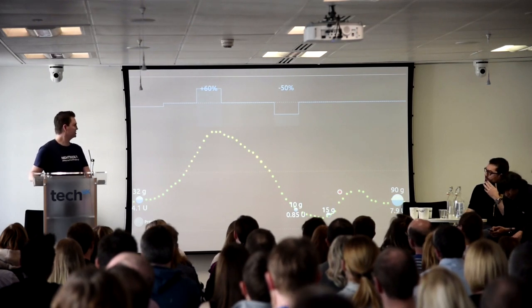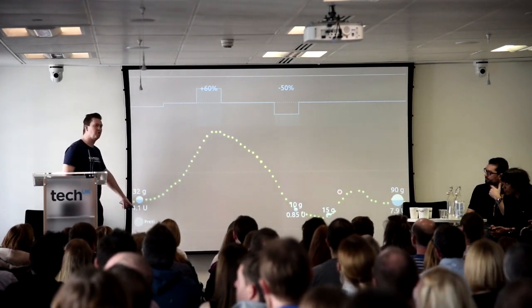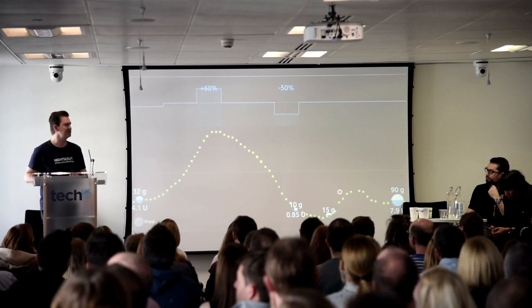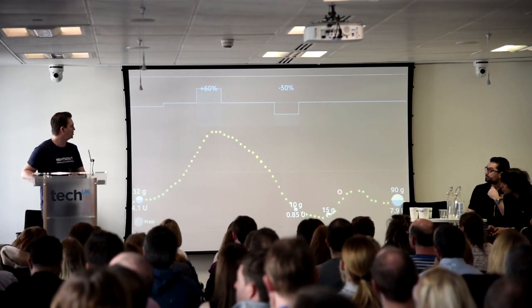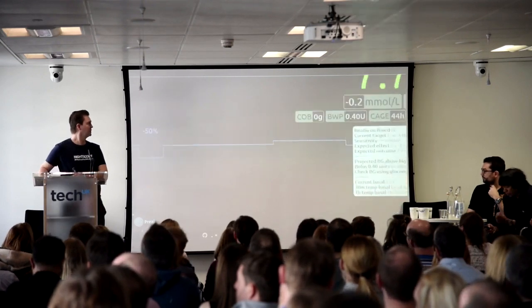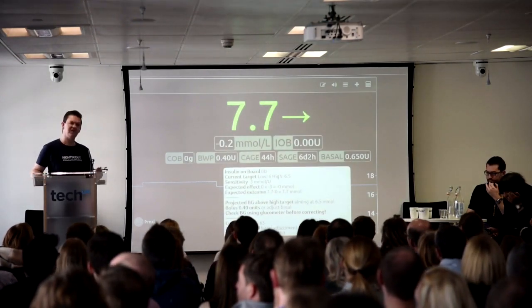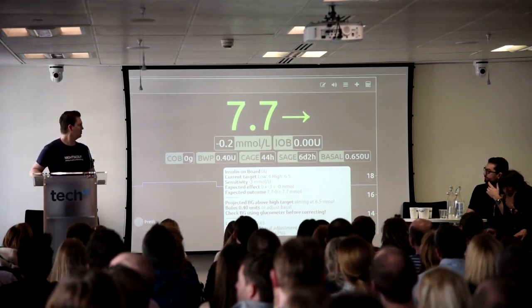So what we can see there is she took 32 grams worth of carbs, 4.1 units of insulin. Interestingly, the colour used for insulin is blue, because that actually turned out to be just water that she was taking. But look at that graph. Some information also quite useful is to know some of the things, no carbs on board at this particular point in time. I'll skip past the BWP onto the CAGE.